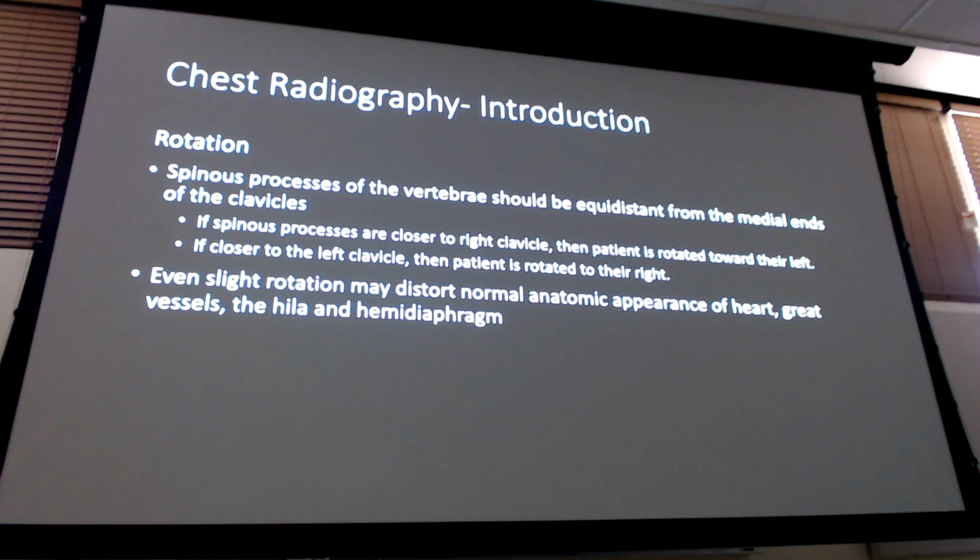Let's get back into evaluating whether or not an x-ray is quality. Rotation. We briefly talked about rotation in the last block, so we'll just quickly cover it again as a refresher, right? There are 2 areas you look for rotation. We want an x-ray to be nice and flat like this, but what happens if the patient just turned, right? How do I know that? So we're briefly going to talk about it.